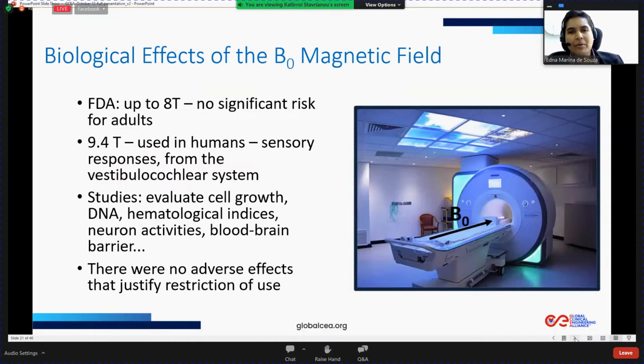So, what are the possible effects of the interactions of high-intensity magnetic fields and their gradients and radio frequency pulses with human body tissues and medical devices? Well, in medical devices, the magnetic fields can essentially induce electrical currents, which can be a risk for patients and the device's integrity, especially considering the devices incompatible with the MRI environment.